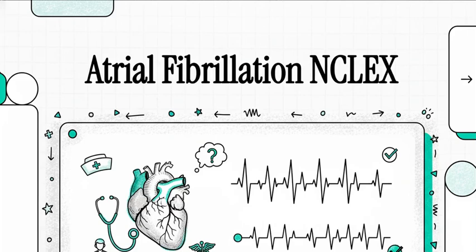Hey, Future RN. Atrial fibrillation, or AFib, is one of the most common and honestly most tested rhythms you're going to see on the NCLEX. It pops up everywhere: med-surg, cardiac, priority questions. So today, we're going to break down exactly what you need to know so you can answer those questions with total confidence. Welcome to ClearPath NCLEX.